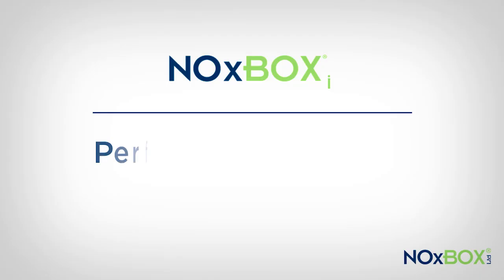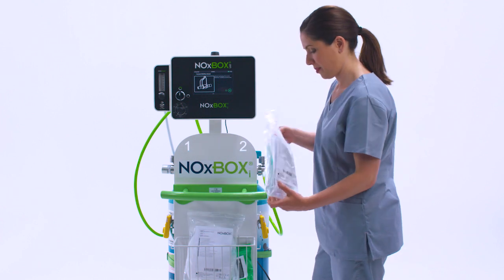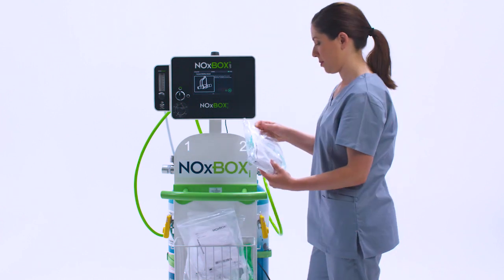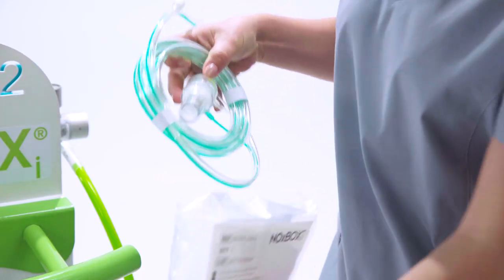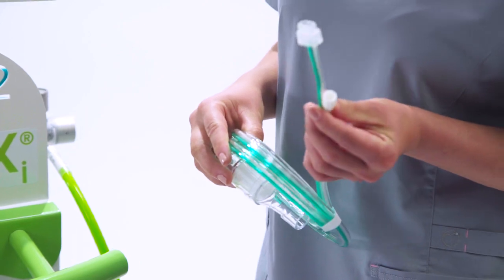At this point, if you are using two NOxEvent gas cylinders, you would now be taken through the same setup process and conduct the same test on the second cylinder. With the leak test now complete, we are ready to connect the NOx kit for the system test. Of the 4 available, select the NOx kit appropriate to the prescribed setting and remove the NOx flow sensor, the accessory device that performs flow detection and injects nitric oxide into the breathing circuit.